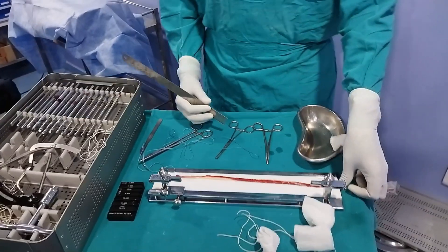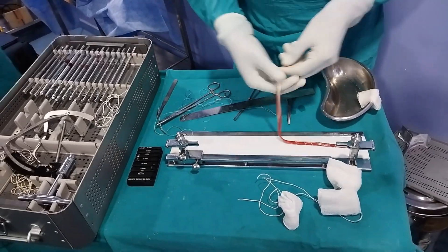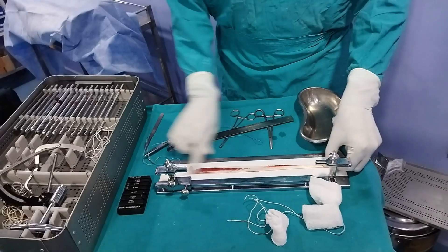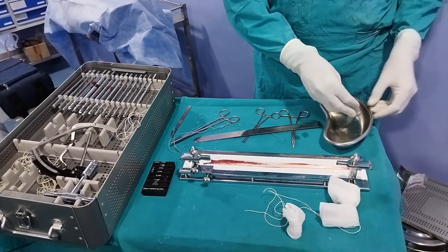Today we are demonstrating how to make a graft for ACL using the peroneus longus. The peroneus longus has already been harvested and now we will prepare the graft for the ACL.